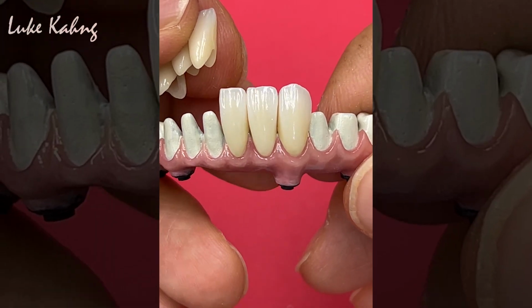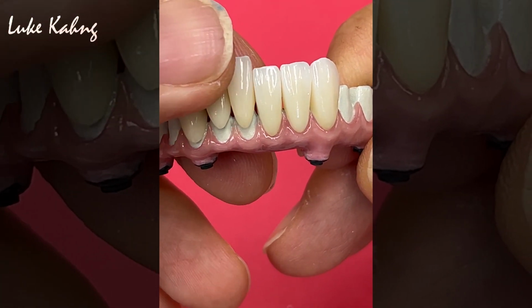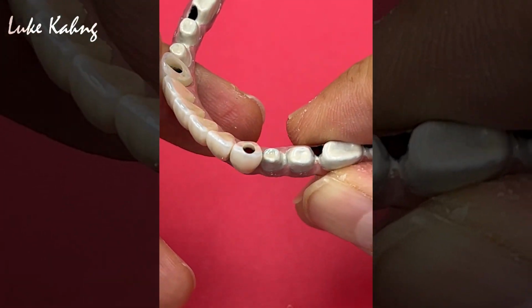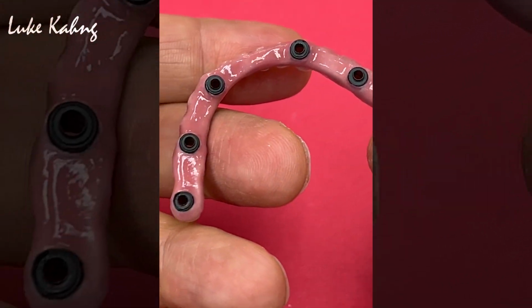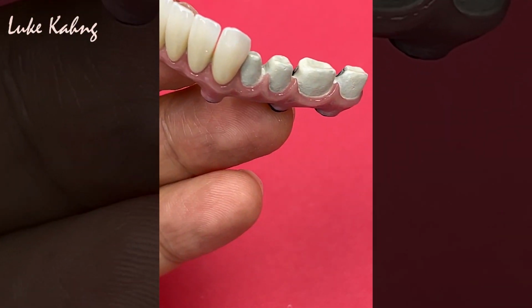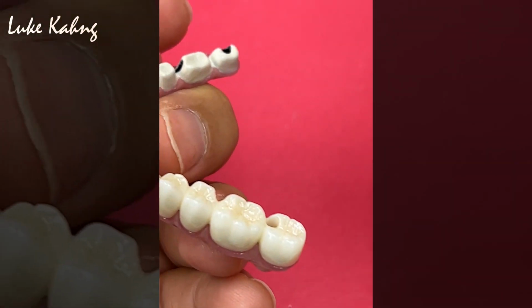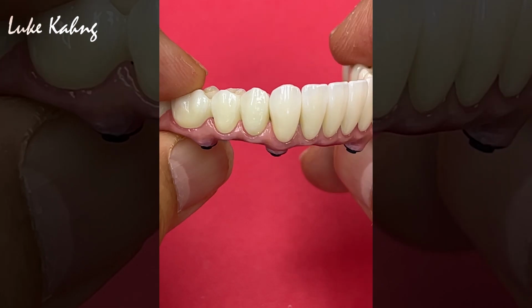So I have to take it out from the model, and this is an individual restoration with exceptional hygiene. Okay, so we're going to glass bead over there, four unit. There's another four unit. This is ready for that. All right.